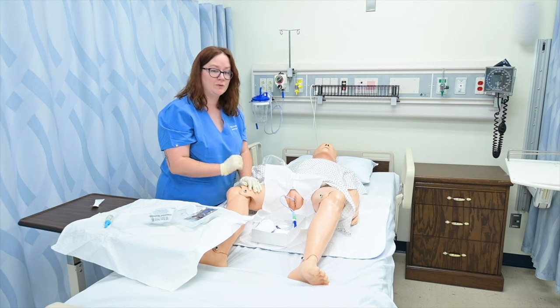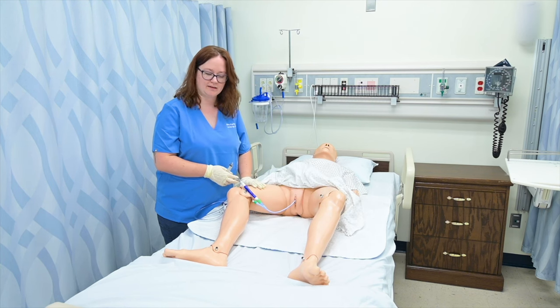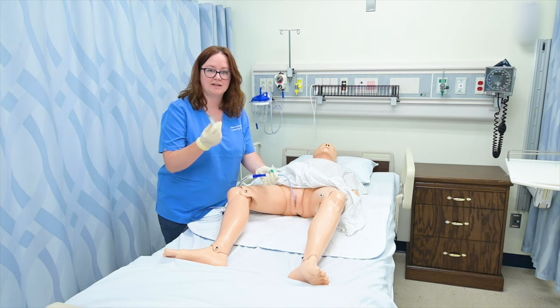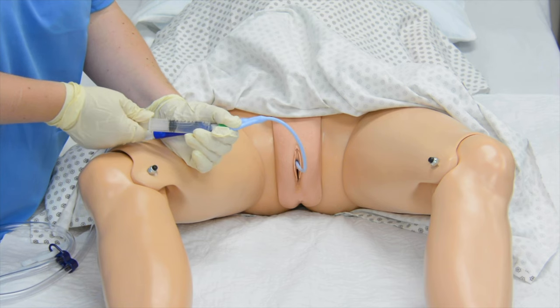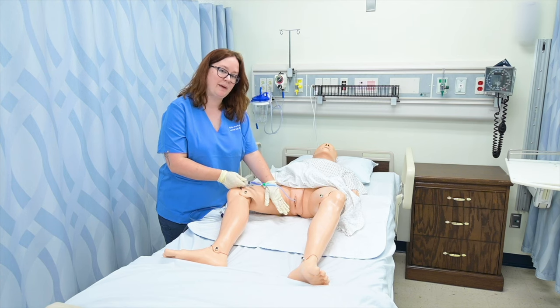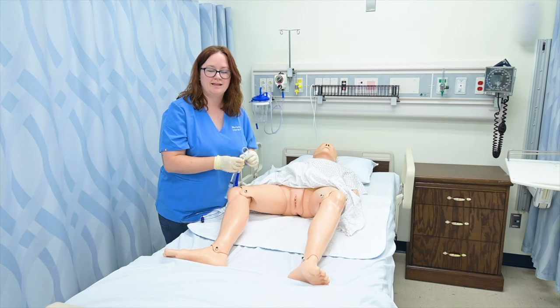And that's how you insert an indwelling catheter on a female patient. Once it's been ordered for my patient's catheter to be removed, I simply reposition my patient. I take the sticker or anchor that's keeping the catheter to their leg, find the balloon port, and get an empty 10cc syringe. I plug that in and withdraw all the fluid so that I don't cause any trauma to the urethra when pulling it out. You may want to put a waterproof pad underneath the patient because this might cause some urine to leak out. I simply withdraw all the liquid from the balloon, pull the catheter out, and then provide some perineal care if needed. And that's how you remove a catheter.